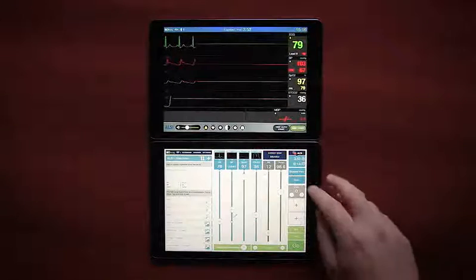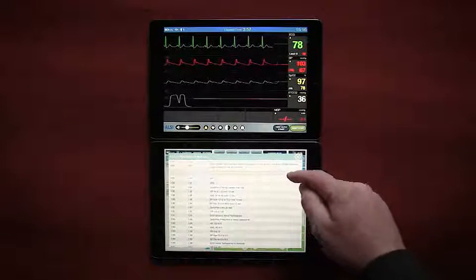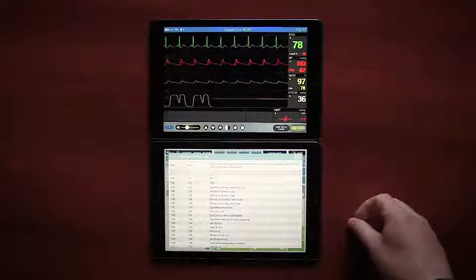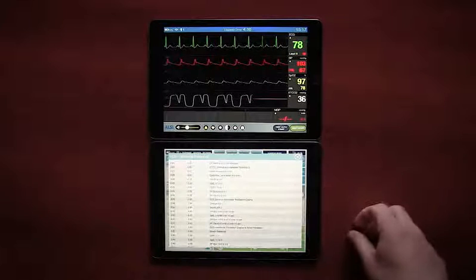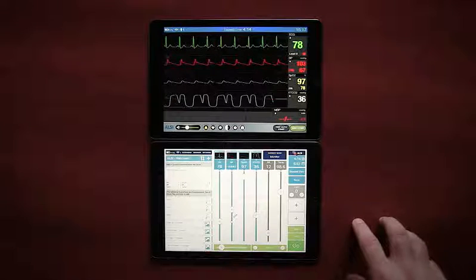And then at the end, the instructor has a nice debrief tool in the event log where it's kept track of everything that's happened during the scenario, including the teaching points that we've touched on. You can see here they've turned green. We have our custom notes that we put in here under the orange section, and then the time-stamped account of everything else that happened during the scenario, which can be PDF'd at the end and kept on file for record-keeping purposes.